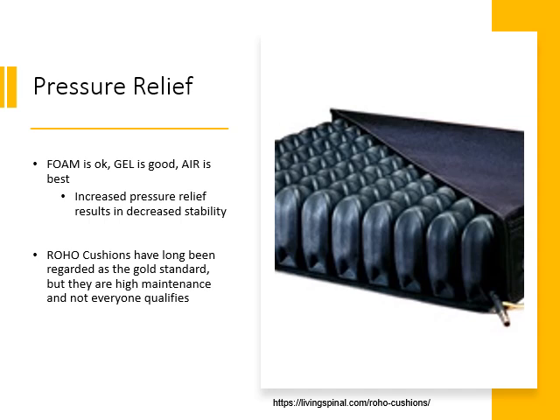The issue about air-filled cushions is that air pressure needs to be monitored and adjusted just like the tire pressure in your car. Air can leak out, and so periodically that air pressure needs to be adjusted. So that's just another thing that the user needs to worry about.